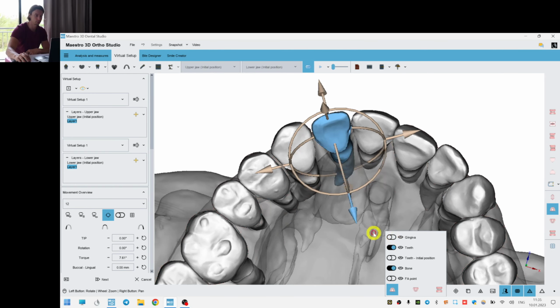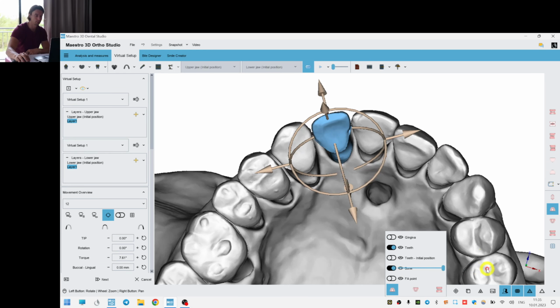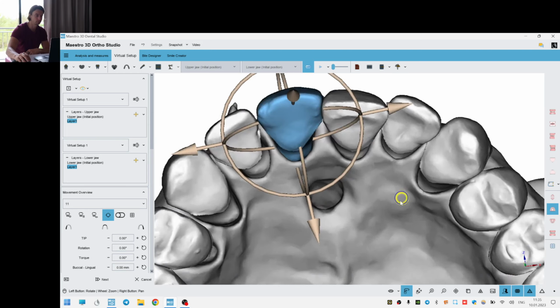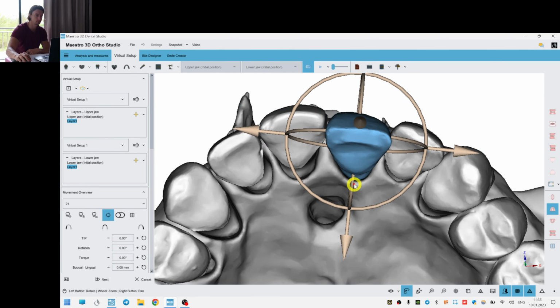Let's remove the gingiva and remove the transparency of the upper bone, of the maxilla bone.